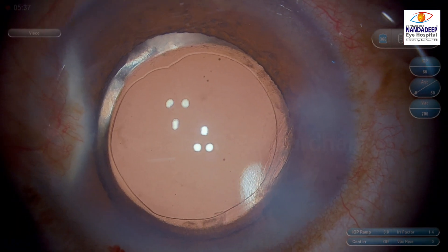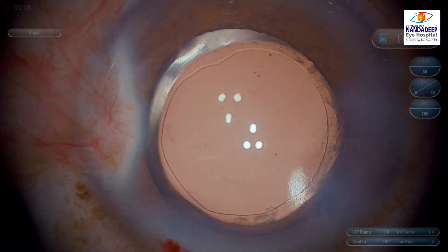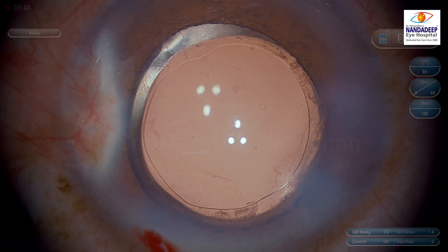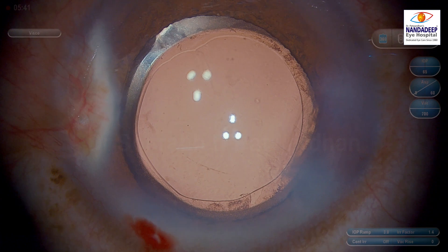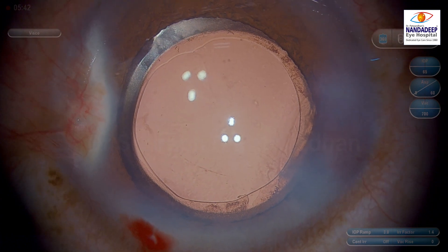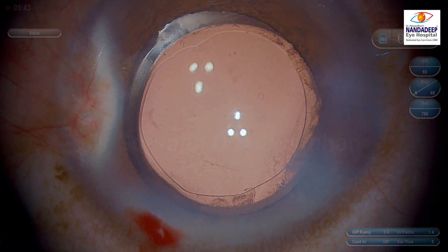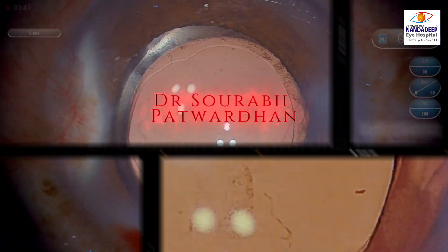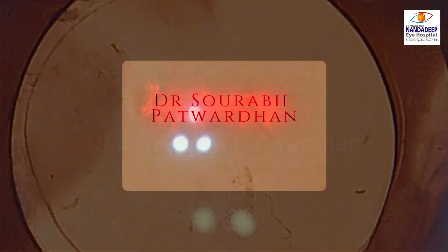I hope that this video will help you understand when doing capsular axis with forceps, so you will know exactly the point where you should re-grasp. Thank you.